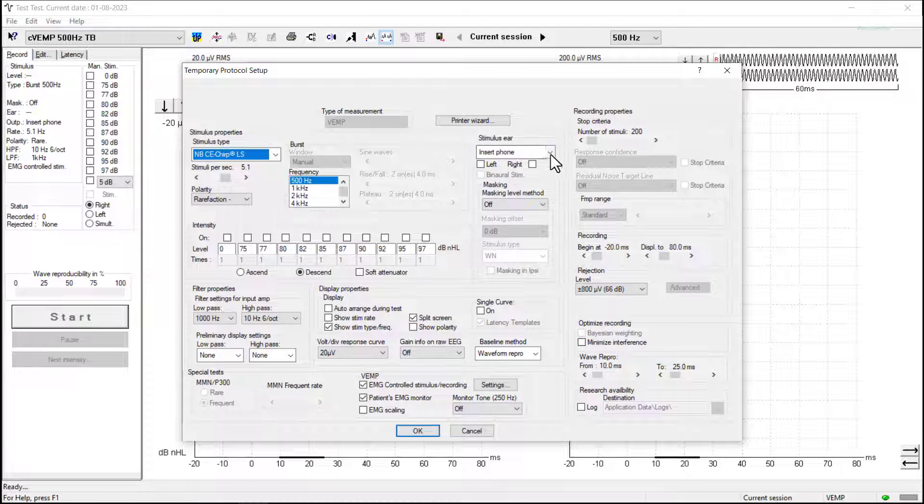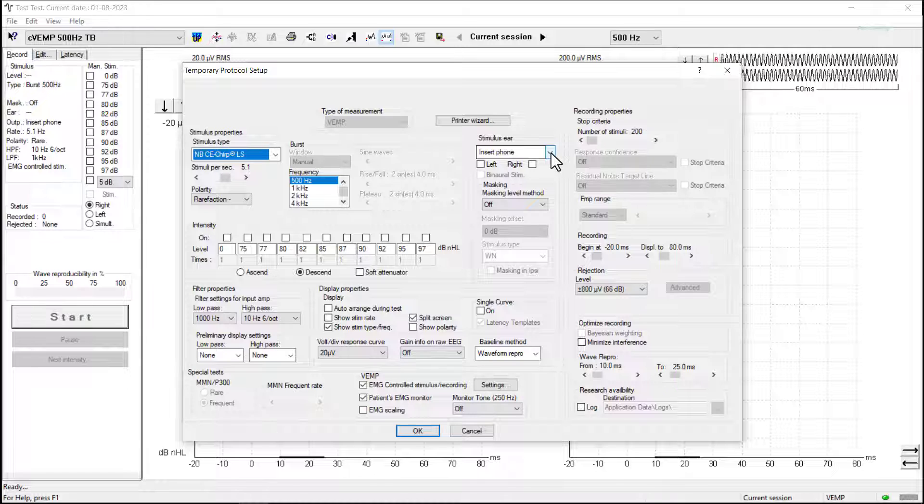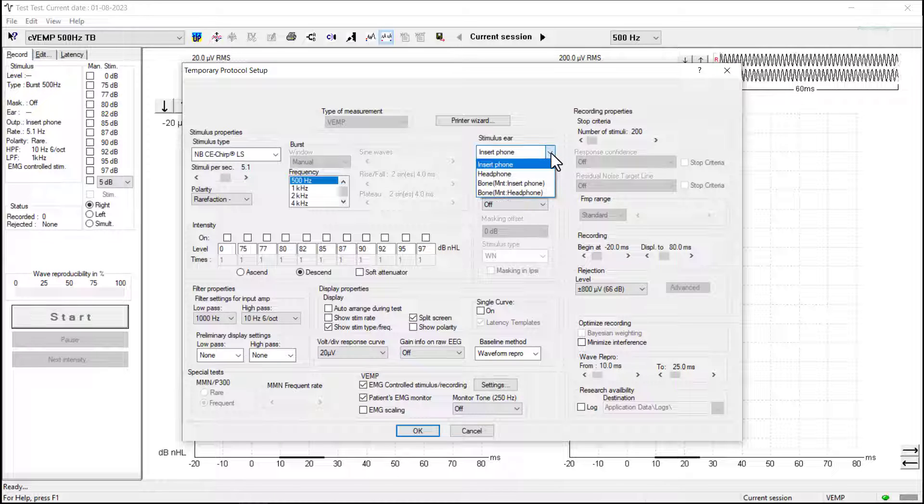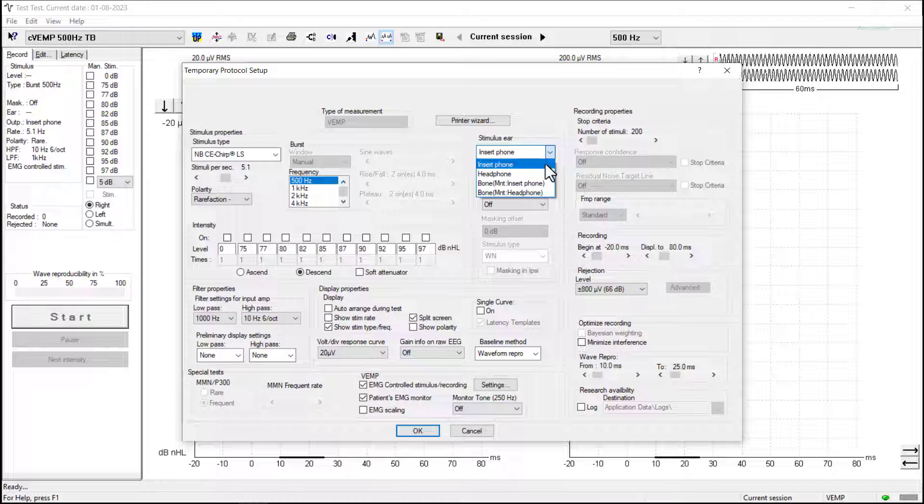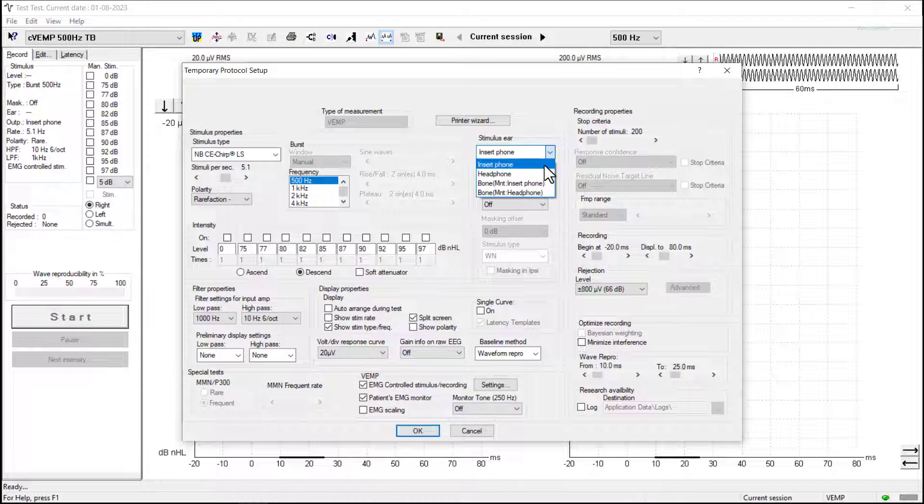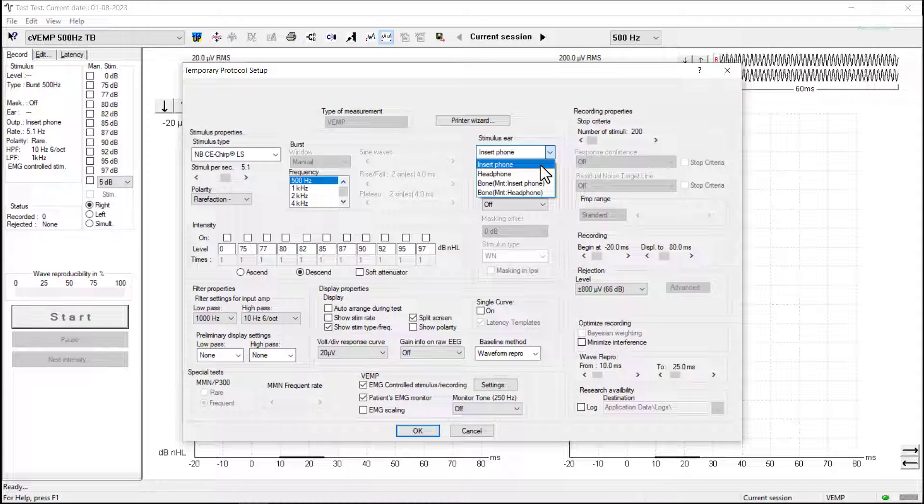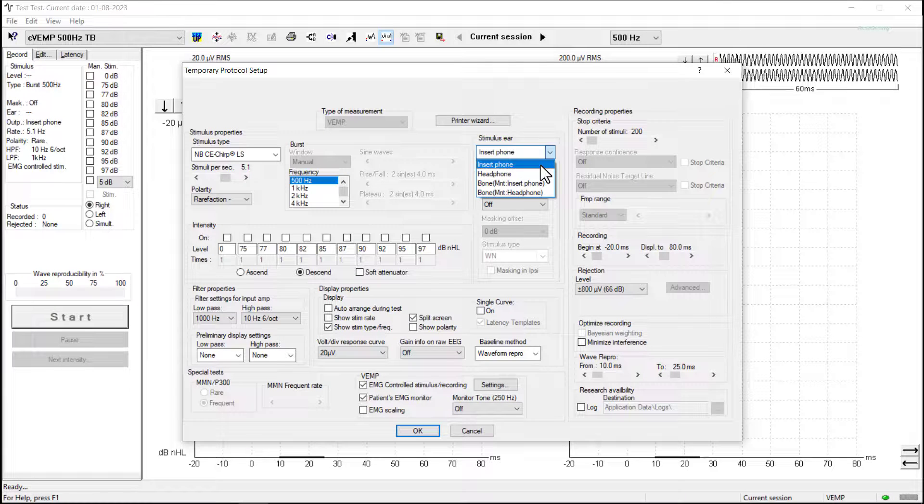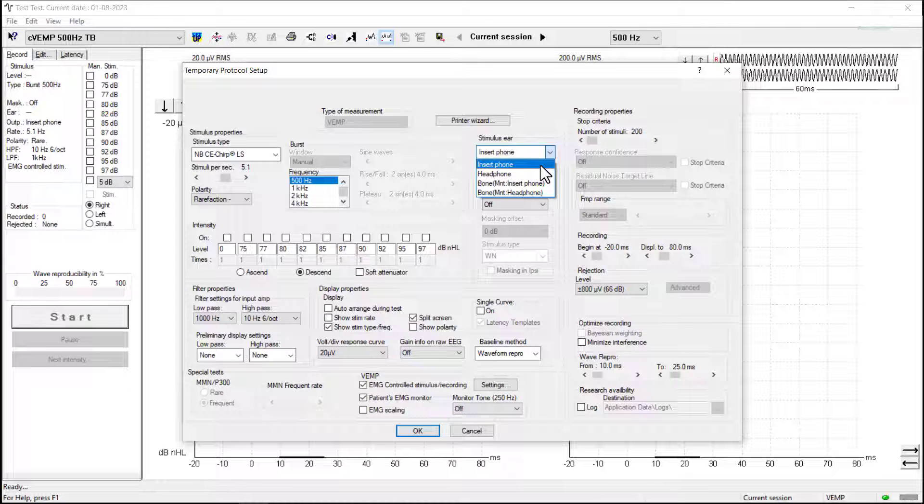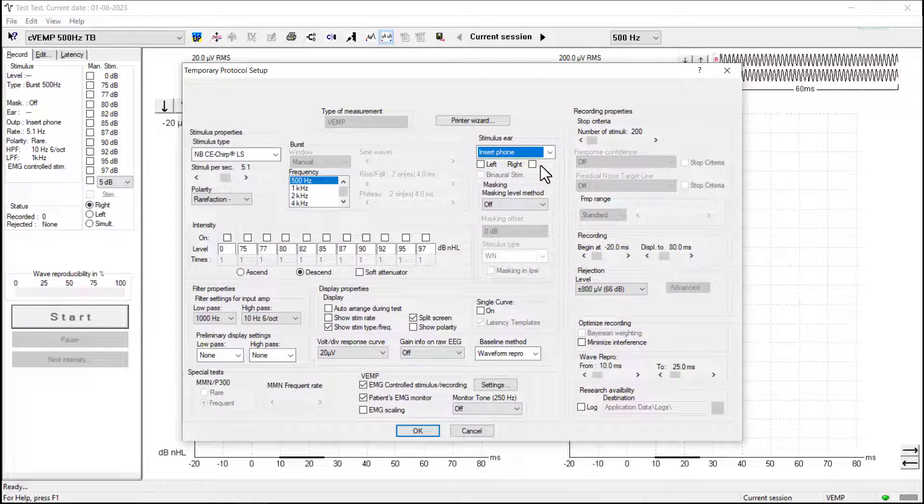The other thing that's important to check is that we're using the correct transducer. Now for this test we are using air conduction, but it's important to check that we've selected either inserts or headphones, depending on which one we're using. We are using insert phones, so we make sure that is selected there.